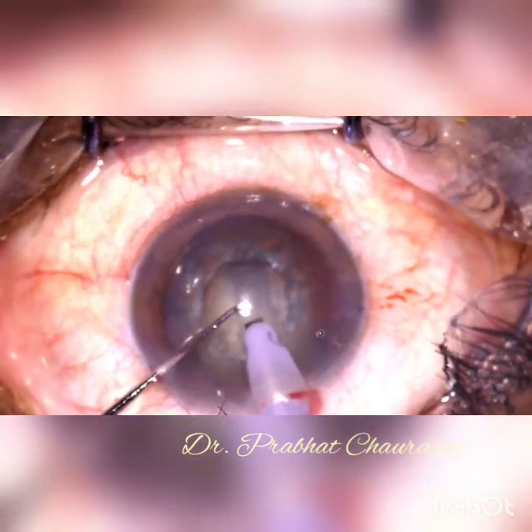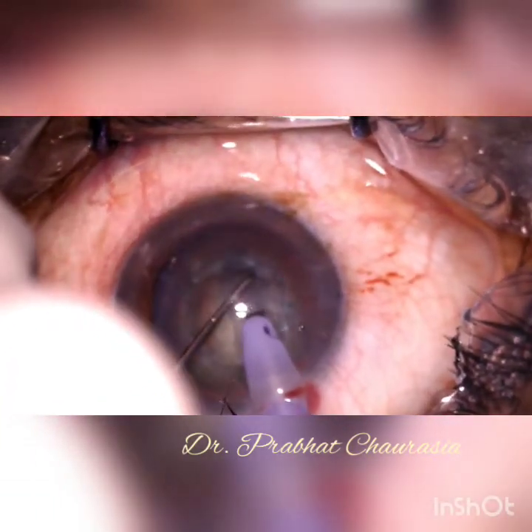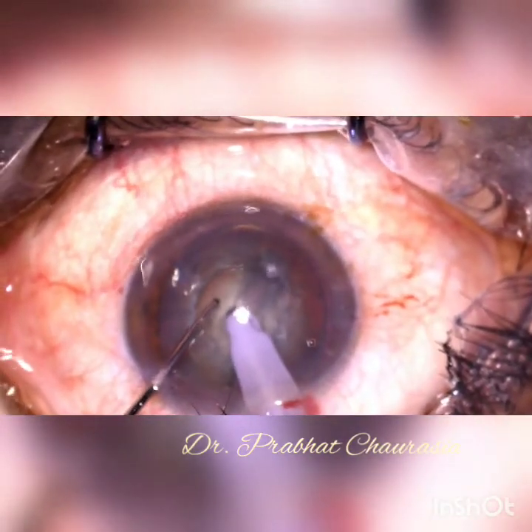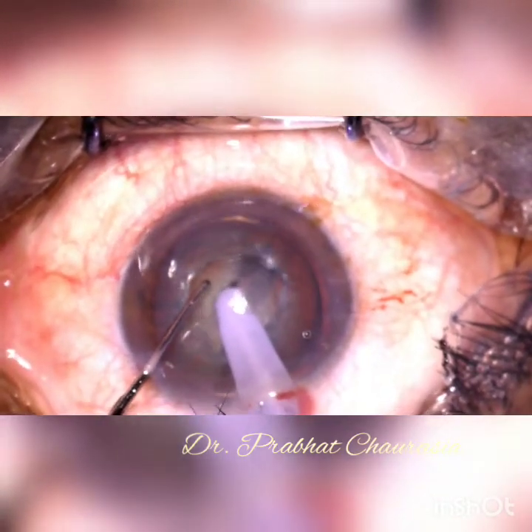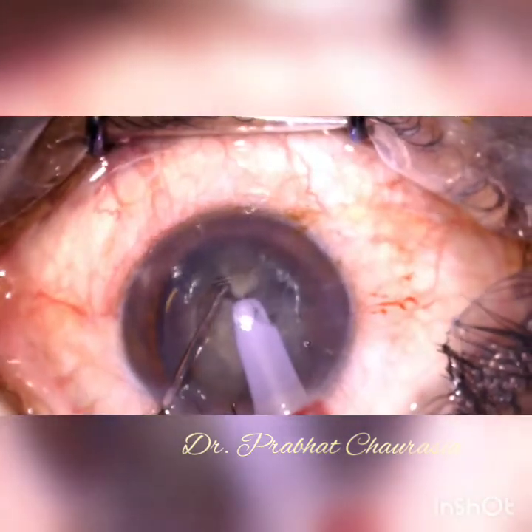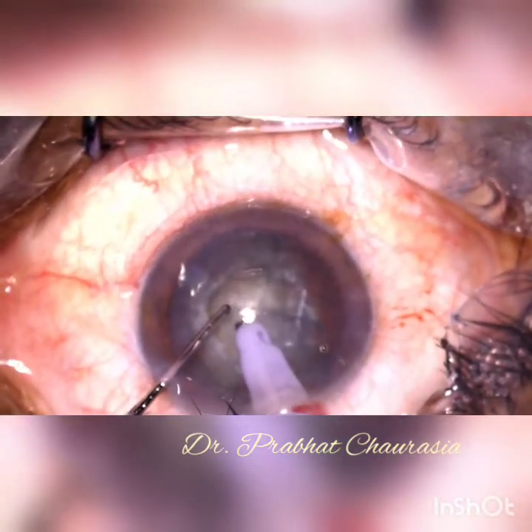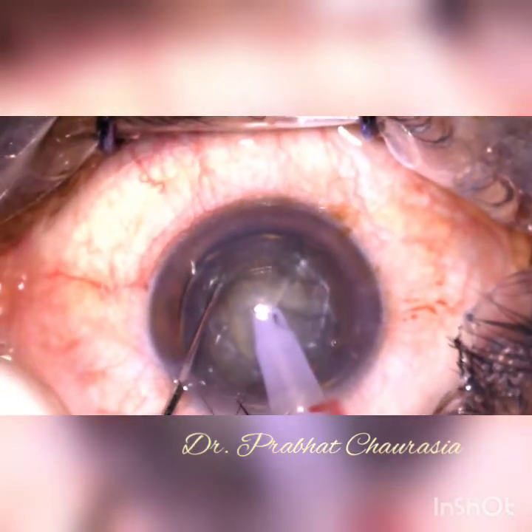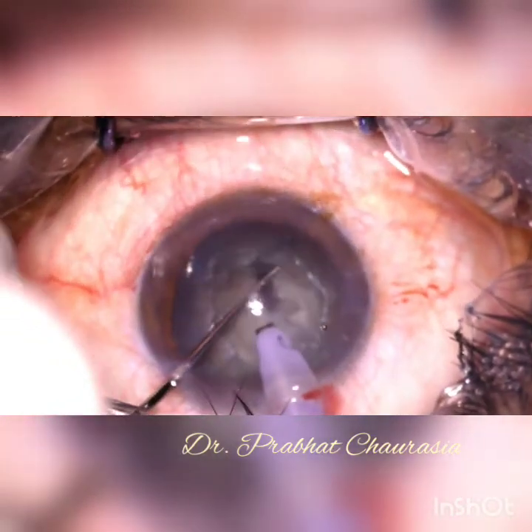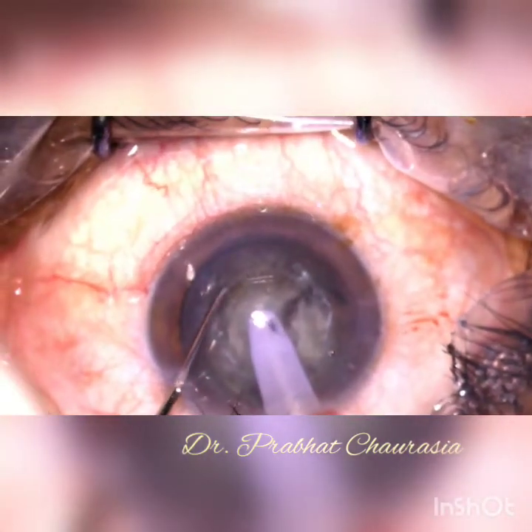After making an adequate size trench, go to US2 mode, rotate the nucleus about 45 degrees and embed the phaco tip. Now again embed the phaco tip, hold the nucleus and then chop it into hemi-nuclei. Rotate the nucleus again, embed the phaco tip, hold the nucleus and chop it. Try to make multiple chops as much as possible.